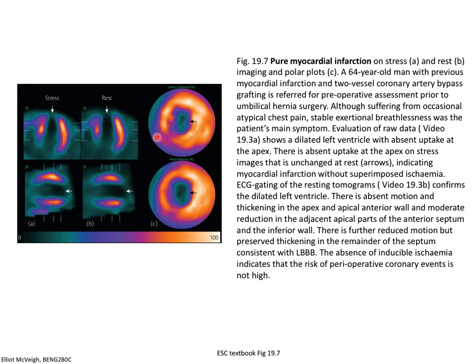Okay? And it basically holds the heart together perfectly fine, but it doesn't contract and it doesn't have electrical activation. It's just a scar. And it is not perfused very well. So under stress and rest, you see this big hole in this person's apex. So this is the long axis. A normal long axis view would look like this. It would be a horseshoe.